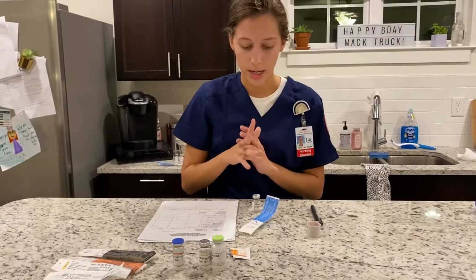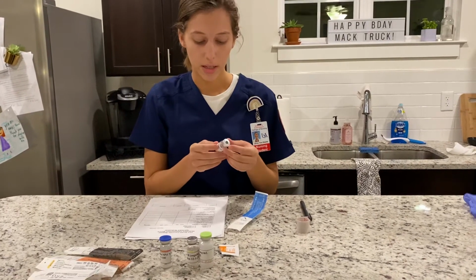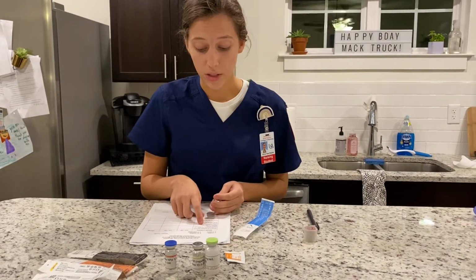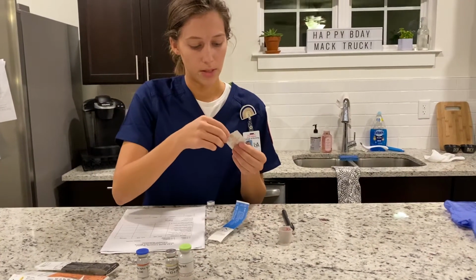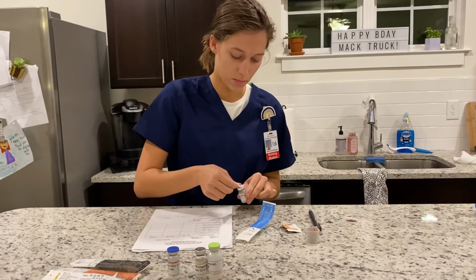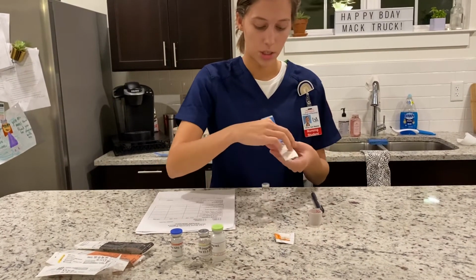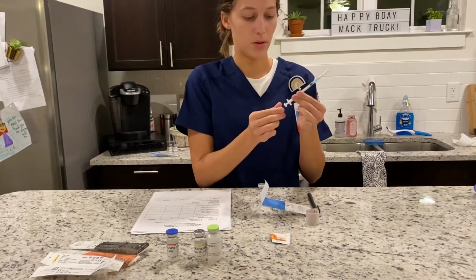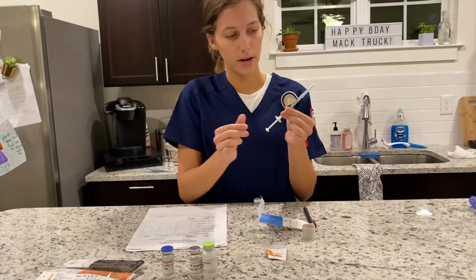So before I begin, I'm going to calculate the correct amount, and I notice on the vial it is given in 10,000 units per milliliter, but on the order it is for 5,000 units, therefore I know it's going to be 0.5 milliliters. So first, I'm going to clean the vial with an alcohol swab. And I'm going to get my syringe. And I'm going to pull in about 0.5 milliliters of air.